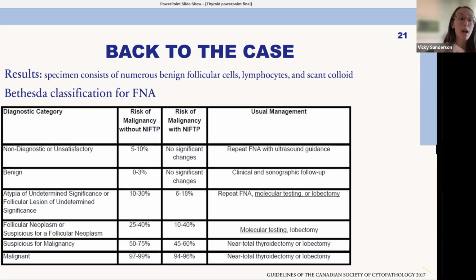In this case, it's benign. There's benign follicular cells. We don't need to worry. The jury's kind of out. I think there are some updated 2025 American guidelines on how often to follow up with these benign fine needle aspirations. They vary from 6 months to 12 months to 18 months. So there's variability on when to do that. The radiologist and the endocrinologist are usually pretty good at commenting on what to do for those situations. But when in doubt, consult your endocrinologist, right?